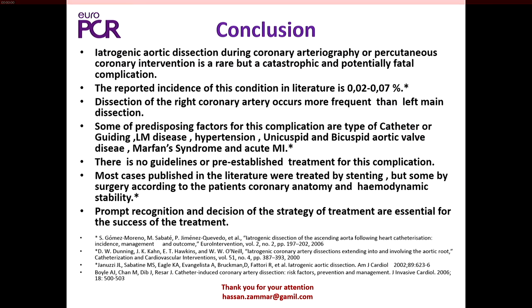But you had a comment. Yes, it was the same thing. I was proposing that before committing to the stent, once you have established TIMI 3 or TIMI 2 flow, you should do an IVUS and look whether you are in the true lumen, and then commit to the stent. I really support the usage of imaging if you are not in very big trouble. In this particular case, you see that after the stent there was a very good flow. But I agree.